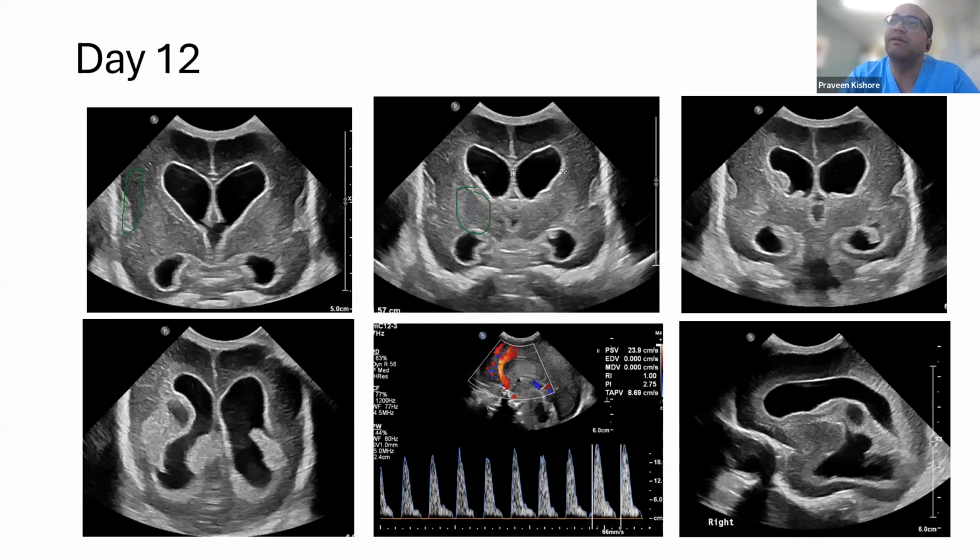So it is very important to know your machine. Very good question, because yes, when there is brightness of the ventricles, surrounding the walls of the ventricles, when they appear bright, that appearance has been called raccoon eyes or panda eye appearance in cranial ultrasound, and that can suggest ventriculitis.